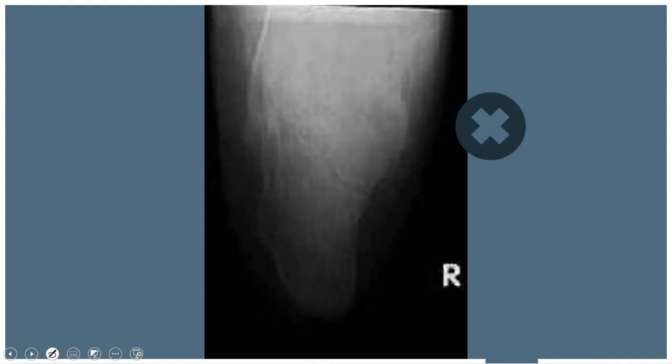Here's a bad heel x-ray example — don't dismiss this and assume the doctor can work with it. This image is blurred, pixelized, and dark. Nothing about this film is good; a repeat x-ray is necessary.